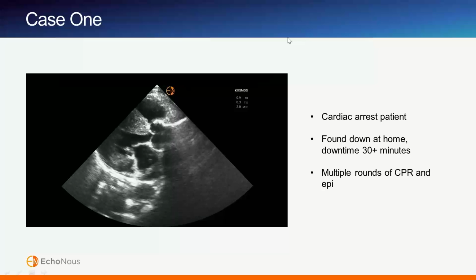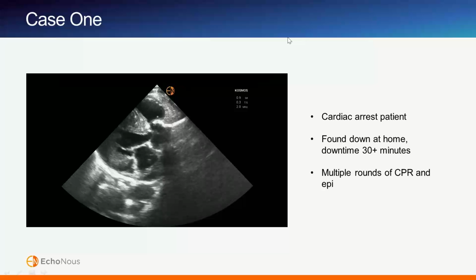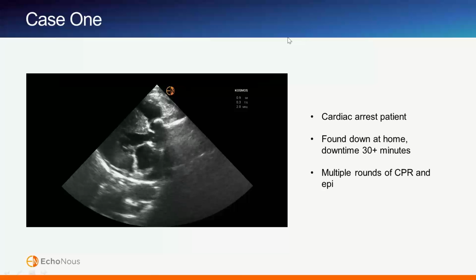Yeah, absolutely. So I think ultrasound in cardiac arrest is super important, and the biggest things we're looking for are reversible causes, and that's on my differential too, looking for RV dilation, looking for how the LV function is. Especially, I'm definitely looking for a pericardial effusion, seeing if there are signs of tamponade. But with this case in particular, we're 30 minutes in. The first thing I'm thinking of is, am I going to continue with the resuscitation based on what I see?